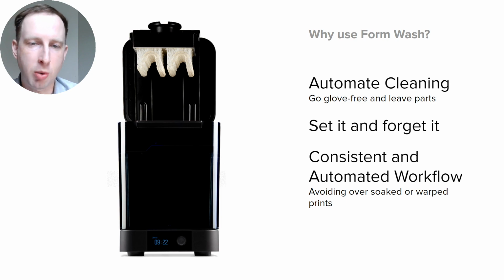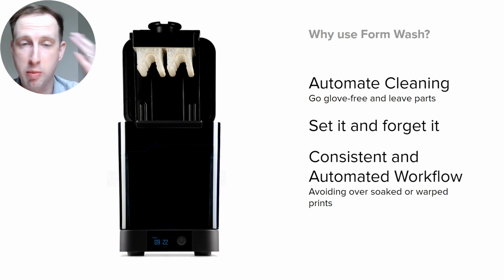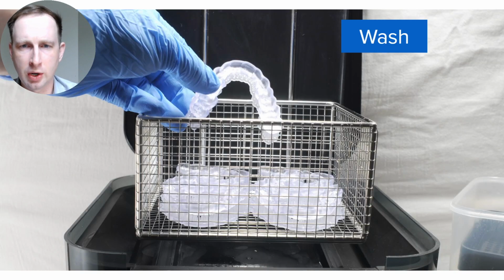And the best part about it is when it's done washing, it pulls out and starts drying for you automatically. With other washing systems, you really have to be there and you can't let it sit in that IPA because it'll degrade the part over time. So this is great. You set it in the wash, you can go to lunch, you can leave for the night, and the parts will just be waiting there, not soaking in the IPA, destroying your parts. Set it and forget it sort of thing. Here's a photo of that deep fryer basket I was talking about, which I like to use a lot.